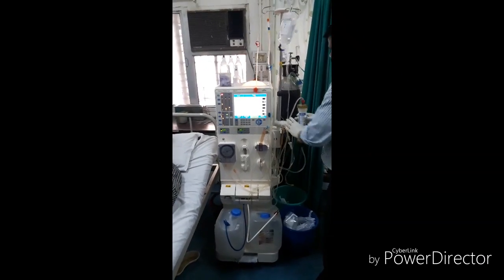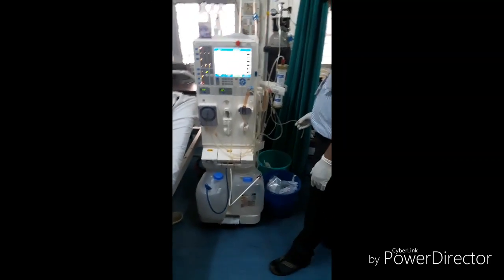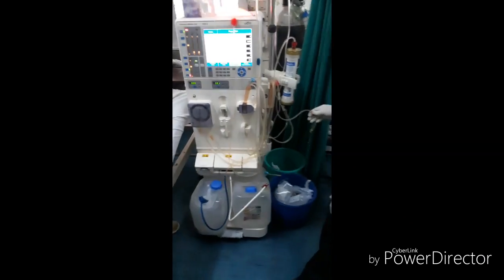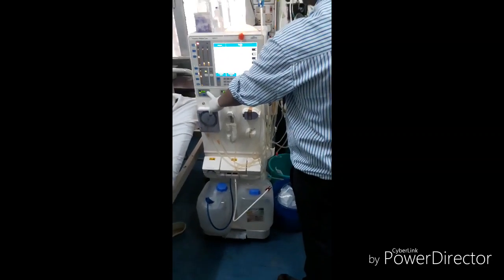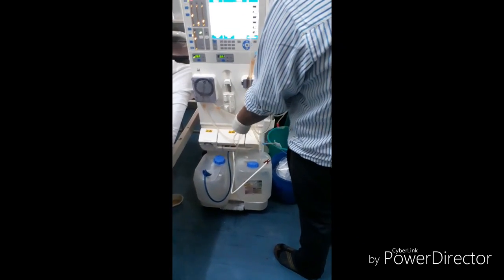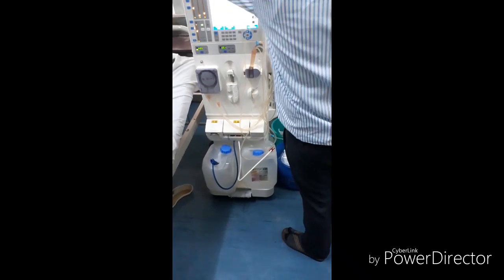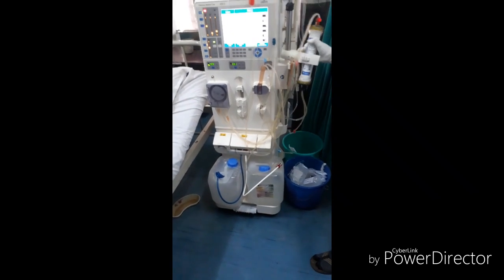The blood of the patient is the area of high concentration — patient ka jo blood rahita hai, that is an area of high concentration with urea and creatinine. The dialysis solution — a bicarbonate solution and water — is the area of low concentration.